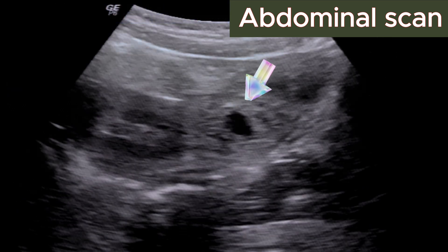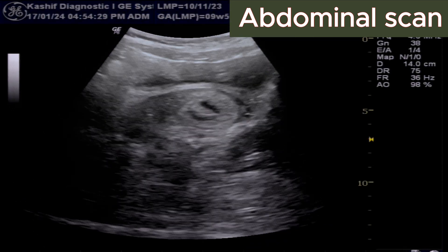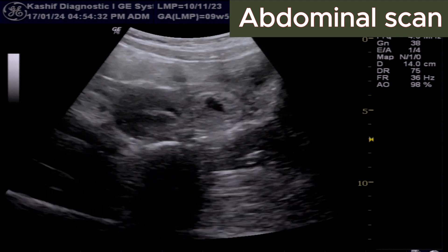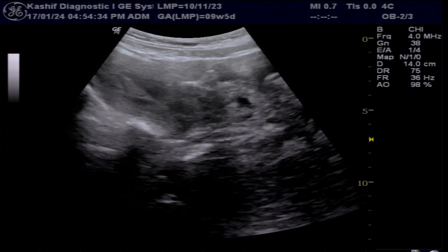We see a thick-walled cystic area just below the cervix. This appears to be in the upper vaginal cavity.